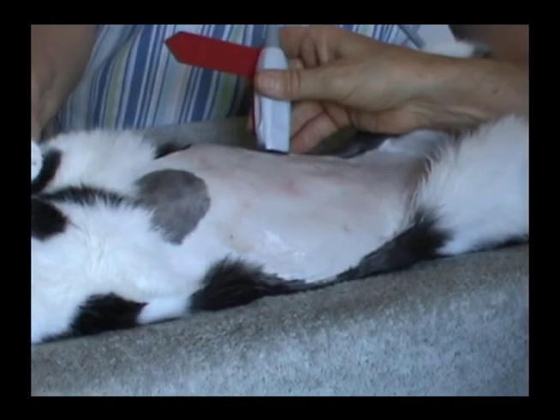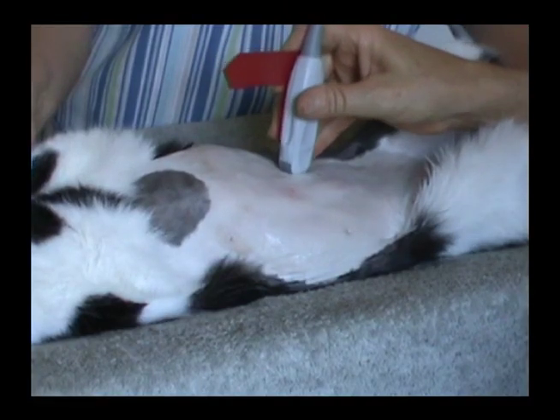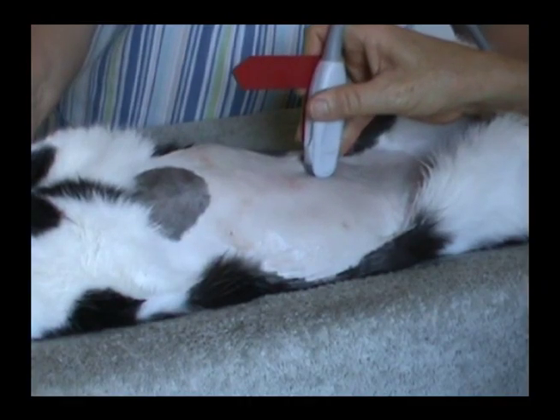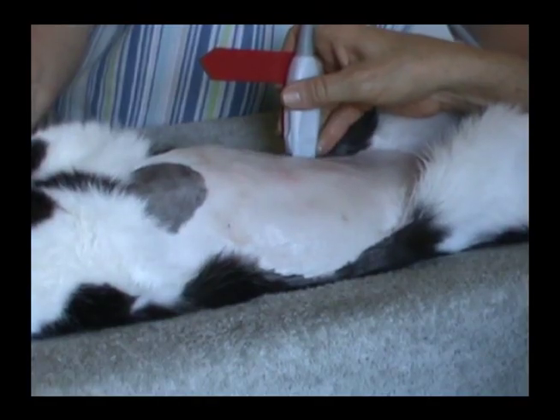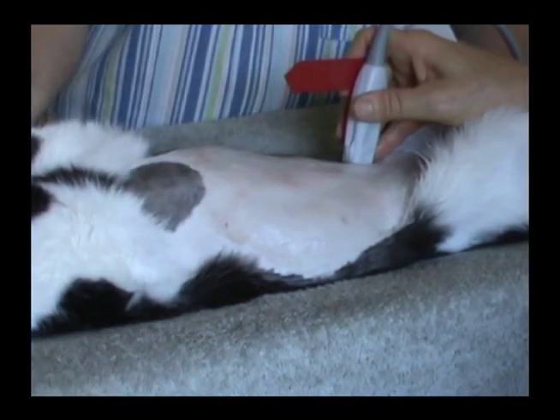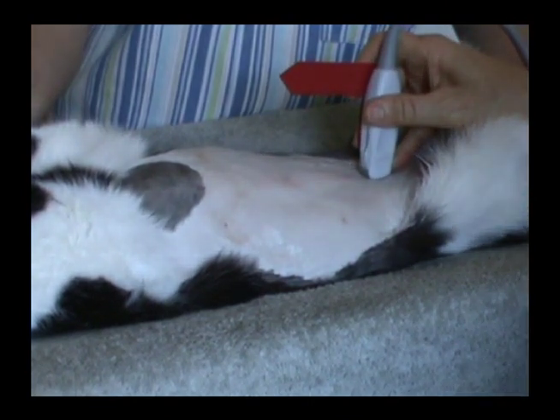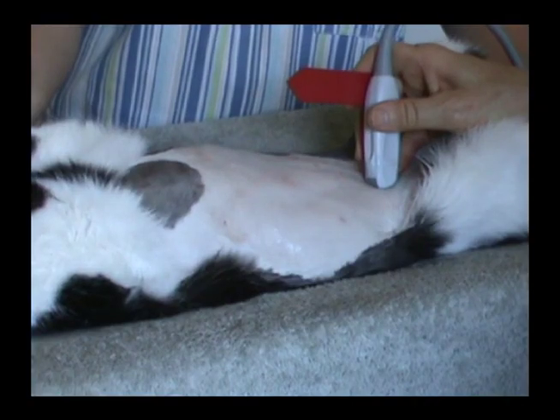From the left adrenal, slide in a zigzag pattern toward the urinary bladder. The purpose of this zigzag pattern is to cover the left caudal abdominal quadrant. If you did not get a good measurement of the intestines while examining the spleen, this is another chance to get one. You should also be examining the ultrasound screen for lesions of the colon or intestines, abdominal effusions, or enlarged mesenteric lymph nodes. We will use a 16-pound cat to find the urinary bladder.